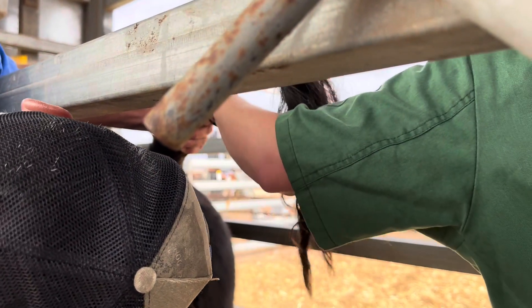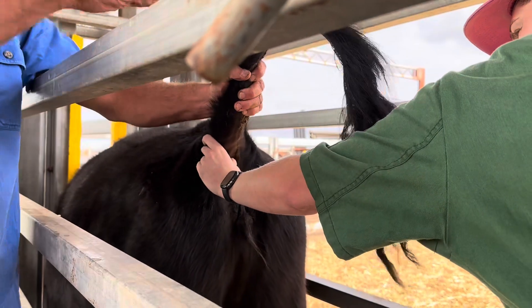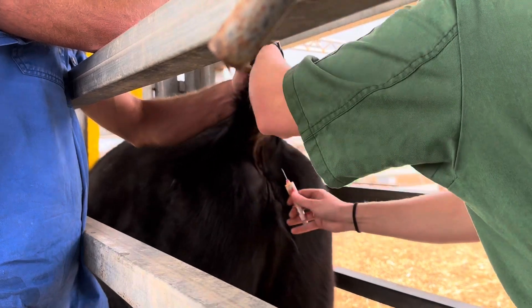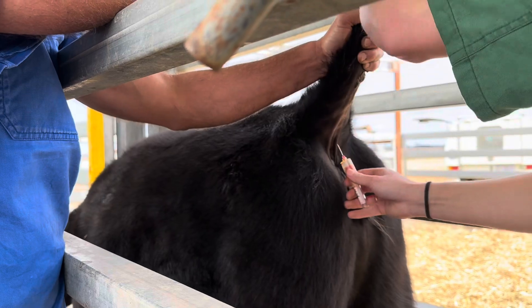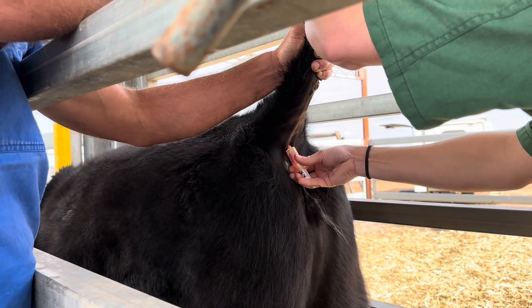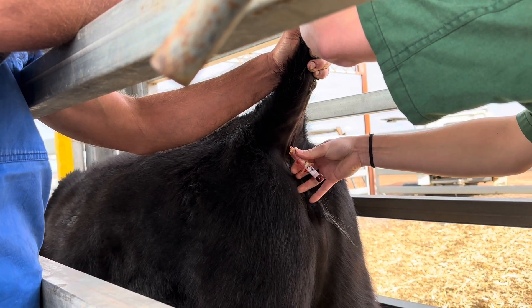I'd probably go about right there. You can feel — if you feel your fingers — there are two processes on those tail bones. So you're going right in the middle of those, and that's where the vein and the artery are always sitting. If you hit an artery, it's going to fill real fast. If you hit a vein, it's going to fill real slowly. Just pop in, and then pop your tube on. Redirect. Beautiful.